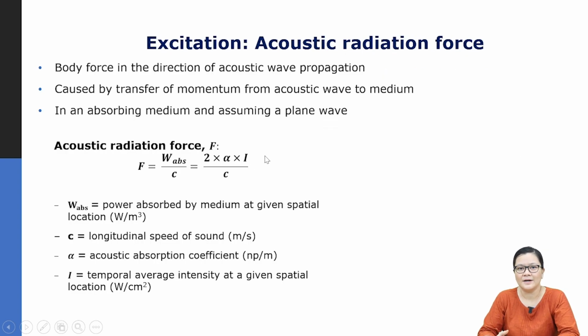I've mentioned acoustic radiation force, which is a way to excite the tissue to induce these shear waves. Acoustic radiation force is a body force in the direction of the acoustic wave propagation, and it's caused by transfer of momentum from the acoustic wave to the medium.